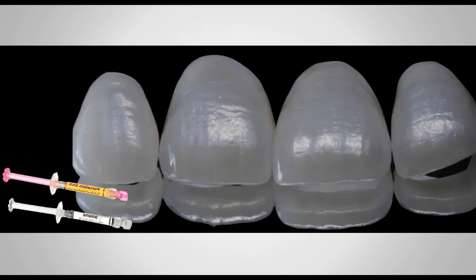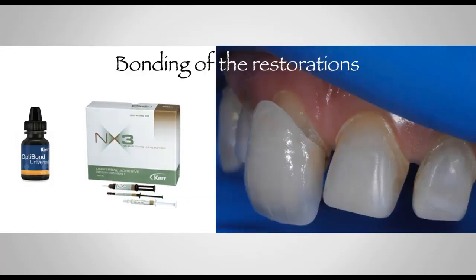Once I try them all, I go ahead and use hydrofluoric acid. This is a feldspathic veneer, so I'm using it for 60 seconds. I rinse the intaglio surface. I apply my silane. So I go through the whole nine yards of the adhesive steps that I'm not going to walk you through right now, but you know these better than I do. And then I select the cement that I want to use to bond my restoration.